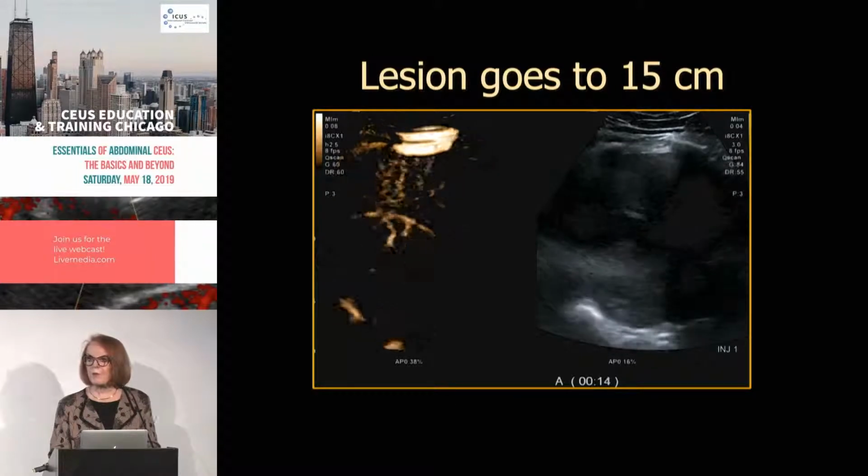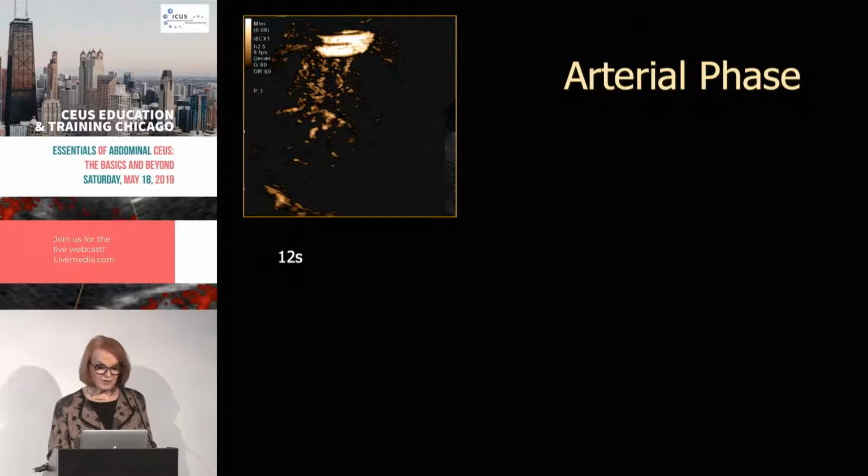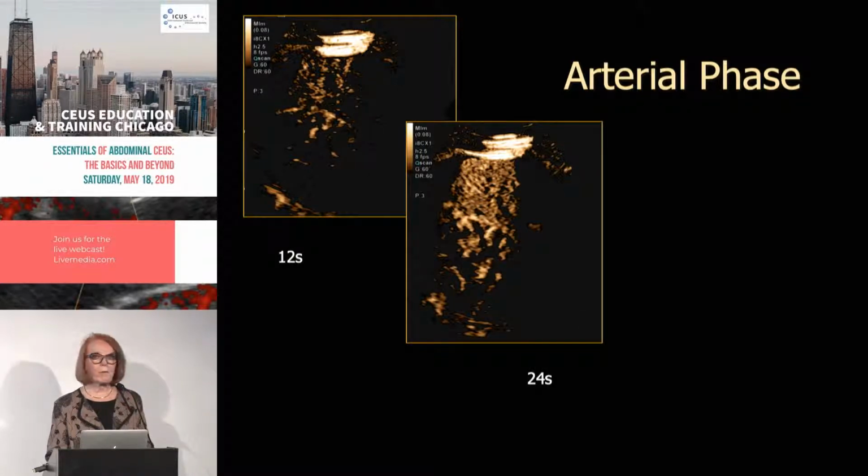So in the proper circumstances, we can go much further, especially if we're going through reasonable liver. So we can... Stephanie, question over here.